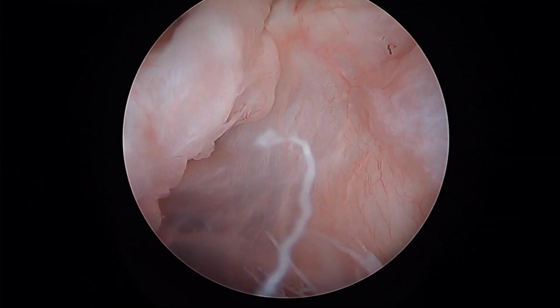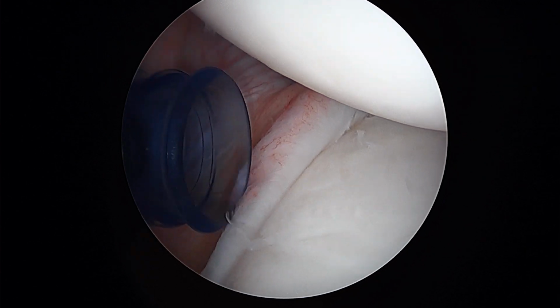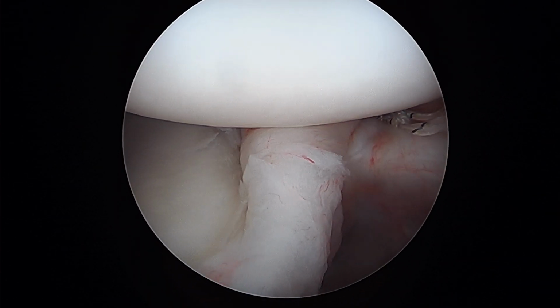Okay, so we've tied that anterior mattress stitch. You can see how there's still a lot of space here, but we've really closed down inferiorly. The other thing you can see is that the ball is getting more and more centered over the head and not slipping out the bottom.